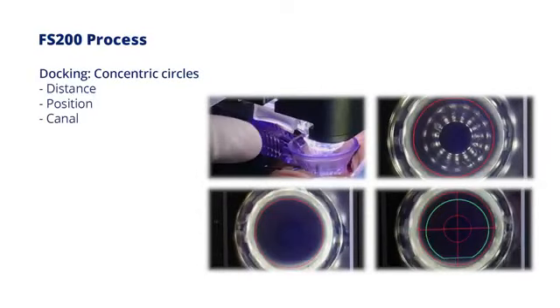Docking is the most important difficult step of SOP. It requires repeated practice. Keep the concentric circles concept in mind.